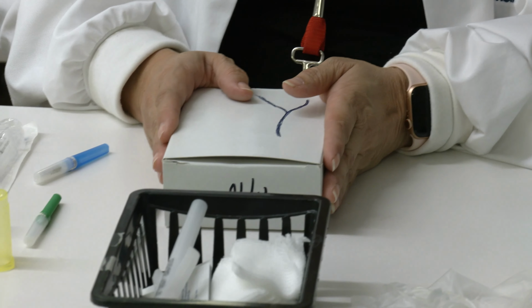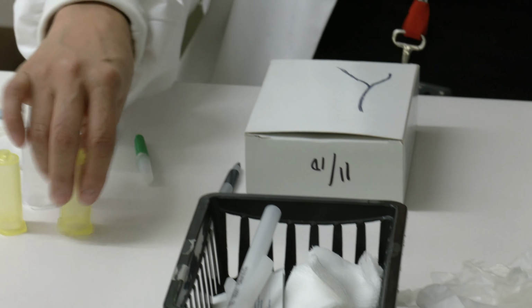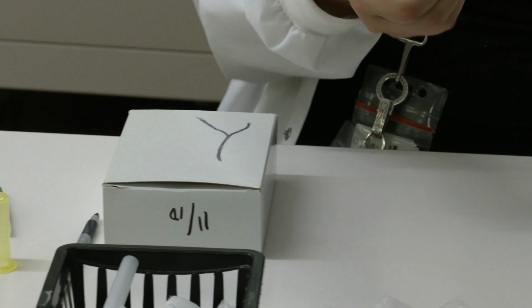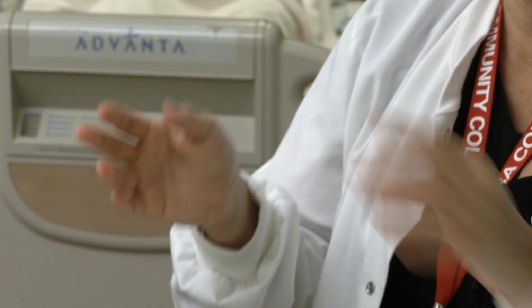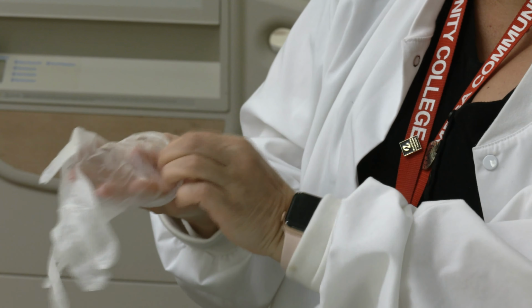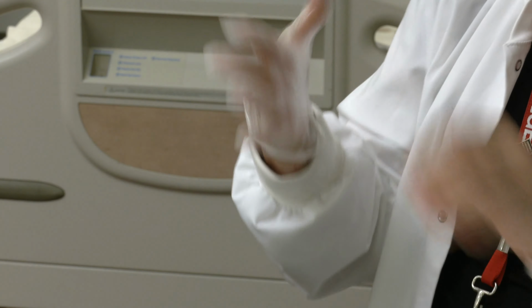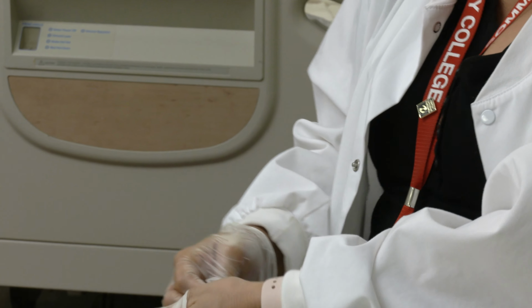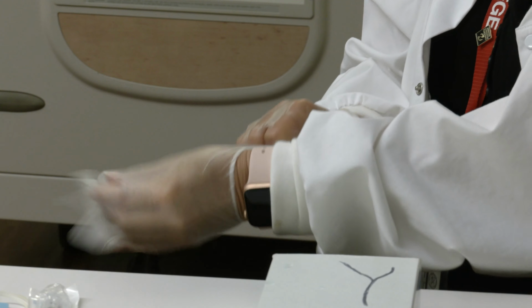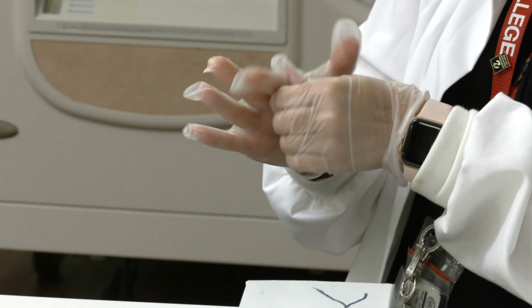So the first thing we're going to start with is the very specific piece of using a needle to get into a vein. So one of the ways that we do that, other than the usual aseptic technique and verifying the order, verifying the patient, making sure all that safety piece has happened, the next piece is to be certain of where you're going to put your needle. Usually we don't have people who are brand new at drawing blood use this particular technique because you pretty much have to know what you're doing when you're doing it. It's not going to give you any clue that you're in the vein.